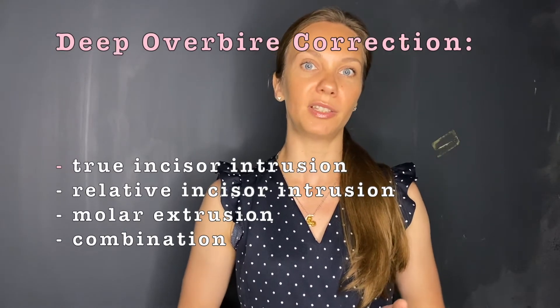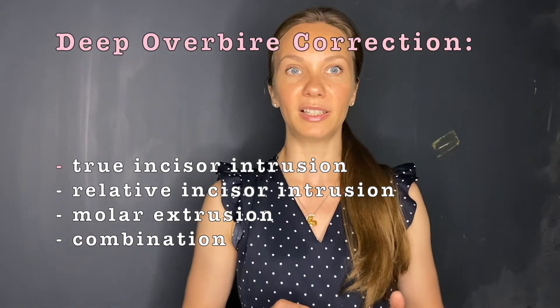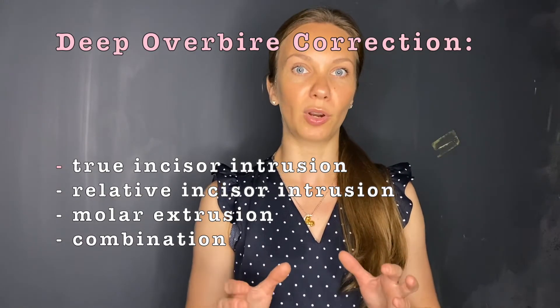Deep overbite correction is usually accomplished by several ways: we can do true incisor intrusion, we can do relative incisor intrusion, we can do molar extrusion, or we can combine several of them and accomplish our goal by simultaneous backward mandible rotation and incisor intrusion.